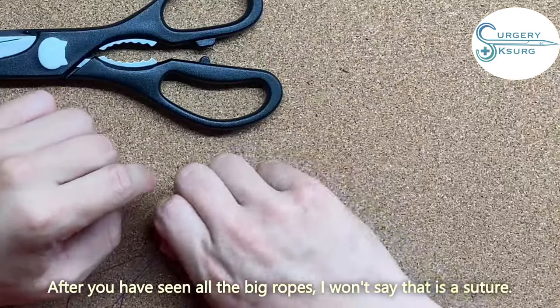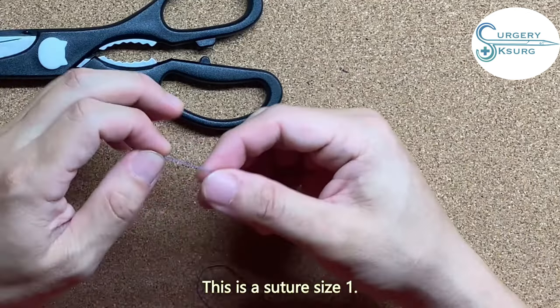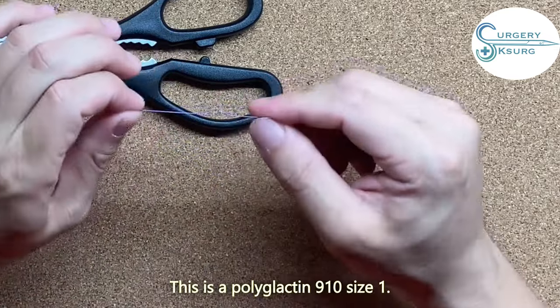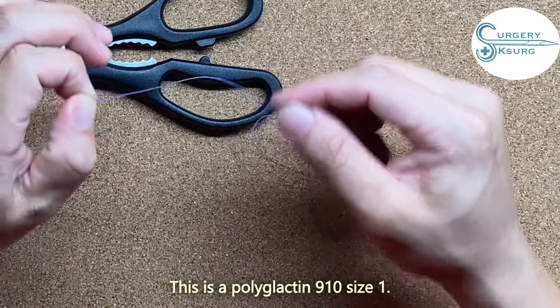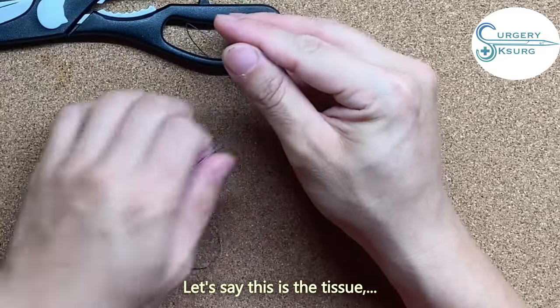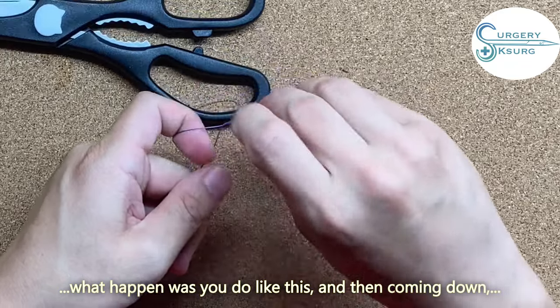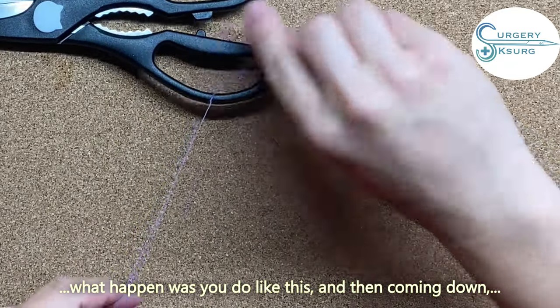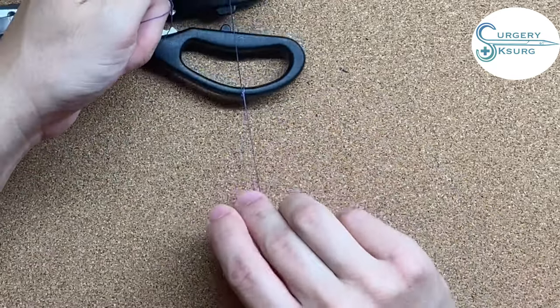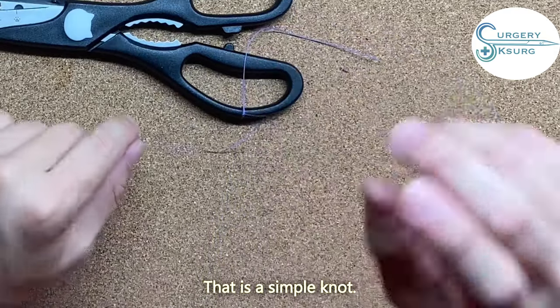After seeing it with the big rope, let's use the actual suture. This is a size one polyglactin 910 suture. Let's say this is the tissue. You do like this, come down, and go up like that — this is a simple knot with the actual suture.